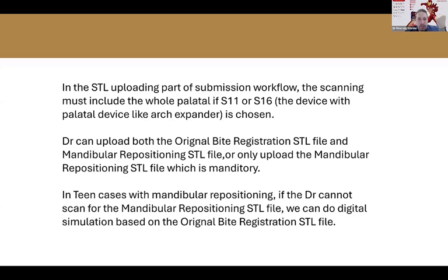And then, as we said before, you can either submit the original bite registration STL file with the mandibular positioning, or upload only the STL file for the repositioning and the full scanning, which is the mandatory one.